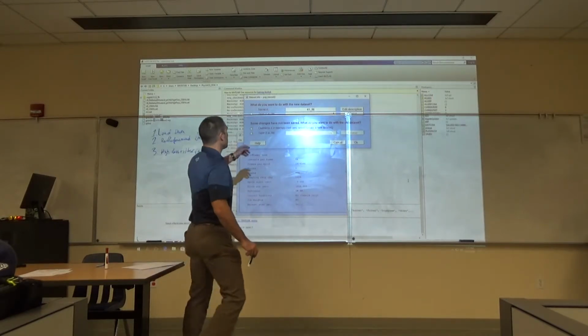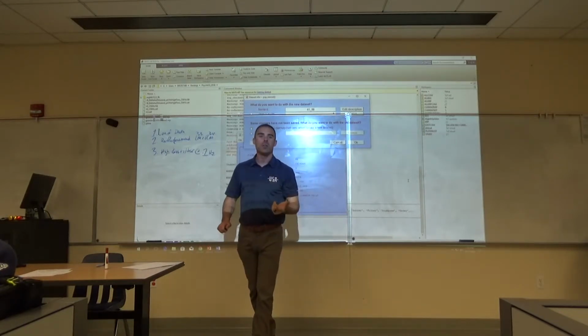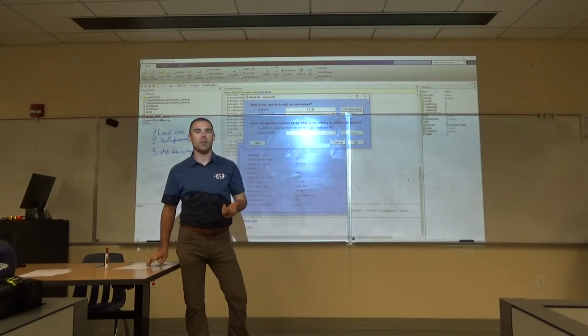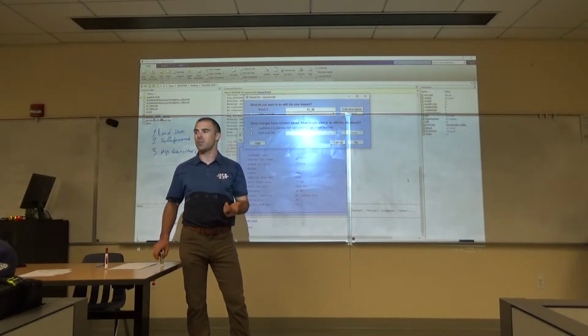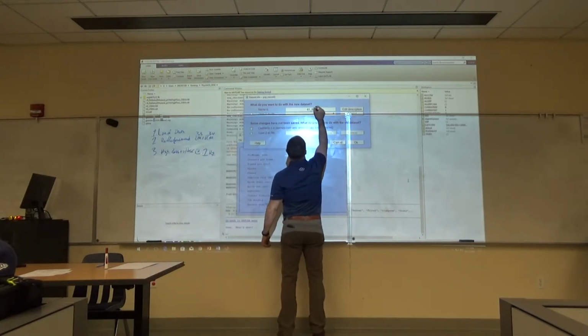Okay, so it automatically appends the name as 41_filt, as in for filter. Now I find that kind of clunky because I sometimes forget what I did to data when I saved it, and I have to come back to it next week and figure out what did I do to this data. So I like to name it a little bit differently. I like to just keep it simple and just get rid of filt.